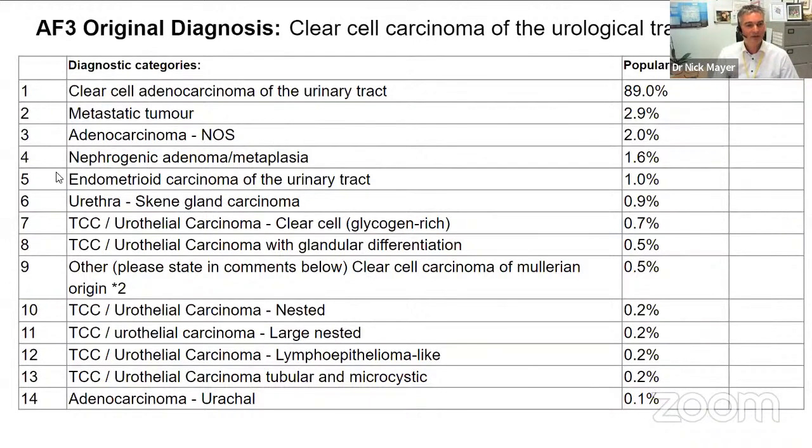So if you're feeling kind, I think maybe we could merge that as correct, in that it's in the Mullerian type of adenocarcinoma ballpark. Skene gland carcinoma, these are the tumors that are the female equivalents of prostate cancer. Now, most of them are usually cribriform or look like ductal papillary. So the morphology here isn't typical, and the immuno again wasn't quite right, although there is some overlap, and we weren't given negative prostatic markers, so maybe a half for that one as well.